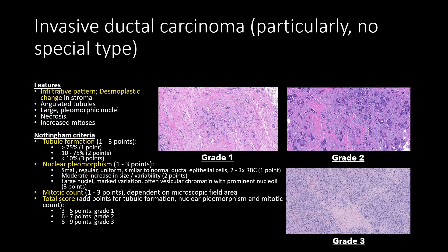Now we can speak about invasive ductal carcinoma — particularly invasive ductal carcinoma of no special type, which is important because there are several different subtypes. Broadly, we now have a lesion in which cells have invaded past the capsule and into the stroma, showing an infiltrative pattern with glands intermixed in the stroma, desmoplastic change surrounding them, more angulated tubules, large pleomorphic nuclei, and potentially necrosis and increased mitoses.